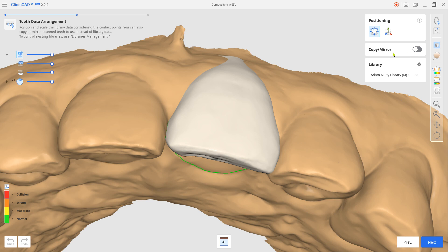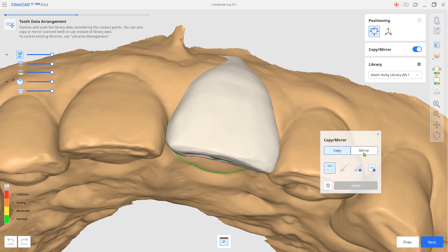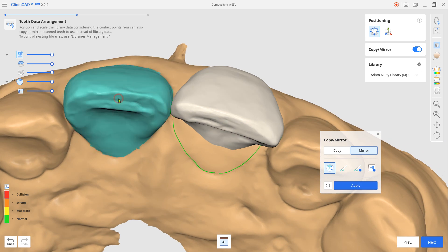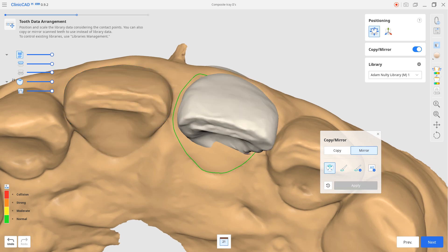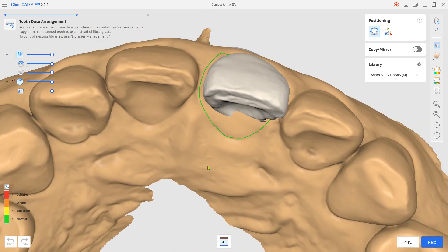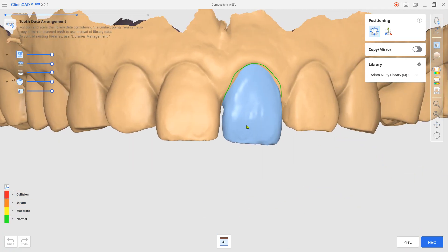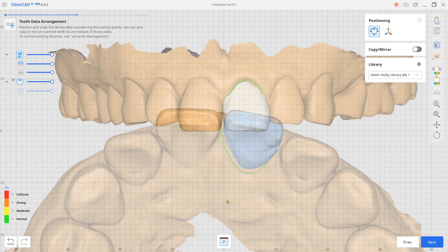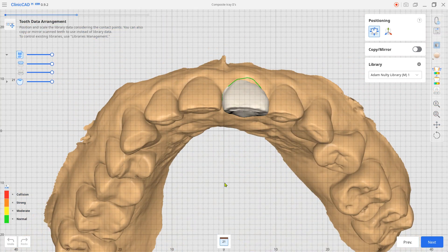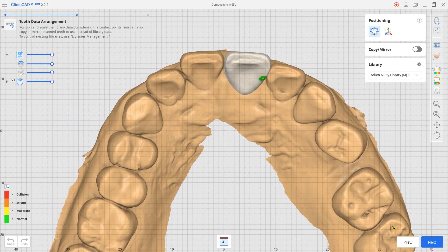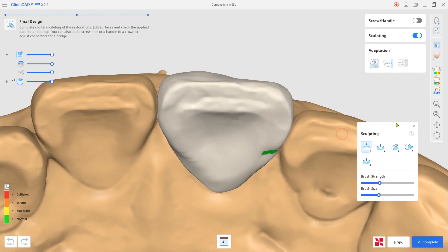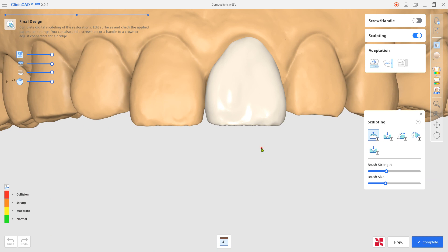If there are adjacent teeth, activate the copy mirror option and duplicate it. Adjust the shape with the sculpting tool if needed.